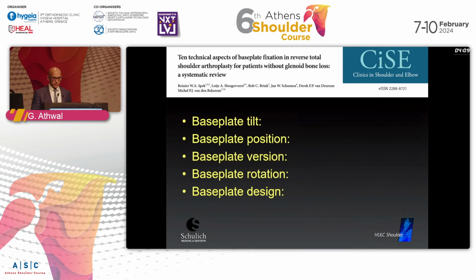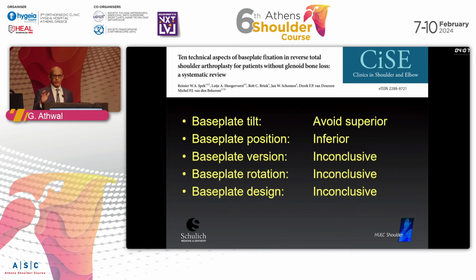Now looking at base plate tilt, the only thing they could recommend is to avoid superior tilt because it has been associated with an increased risk of failure. Base plate position, very traditional style, keep the base plate nice and low to decrease the notching. Now with respect to version, rotation, and design, so design means, was it curved back, flat back, round or oval? They couldn't make any recommendations. So there's many different companies out there that have various different designs and sizes and shapes. So I think right now, the literature would support using any one of those.